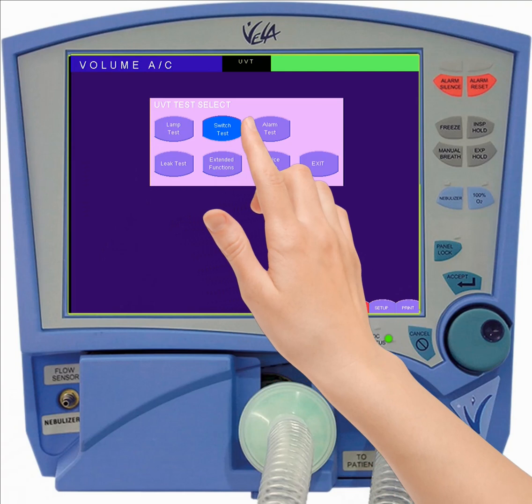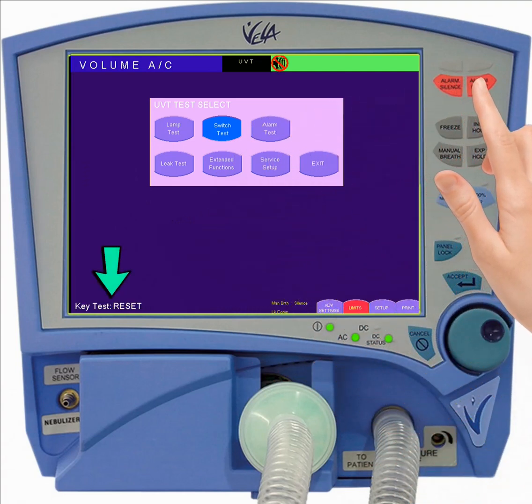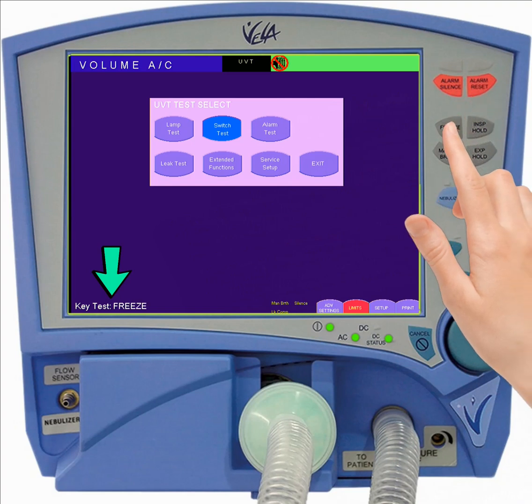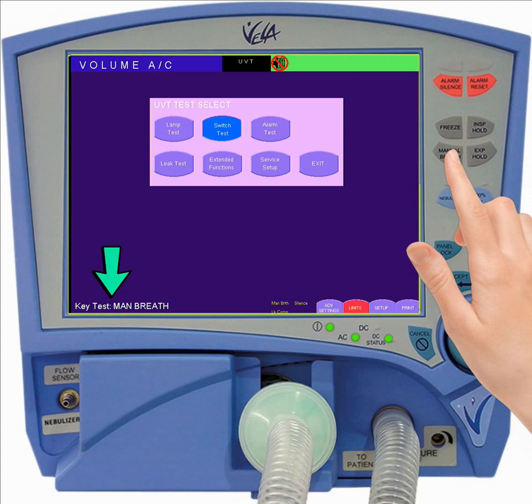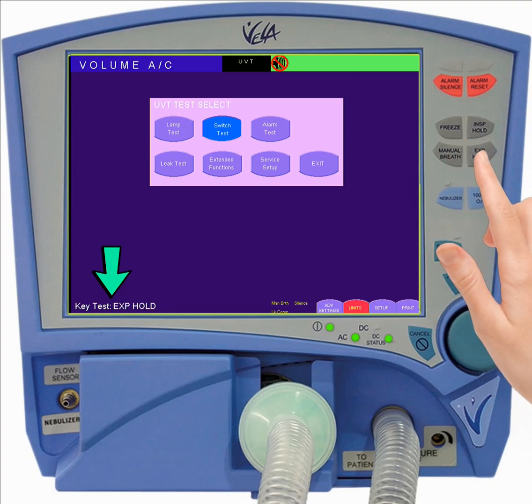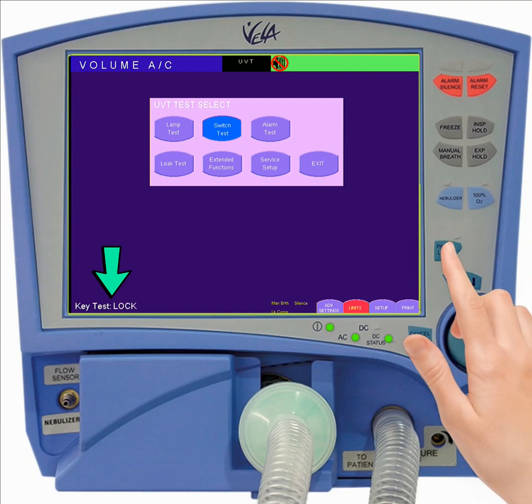The switch test will allow you to confirm the functioning of the eleven buttons located on the front panel of the ventilator. As you press each button in sequence, its label will be displayed in the lower left-hand corner of the display, allowing you to confirm the functioning of the buttons.